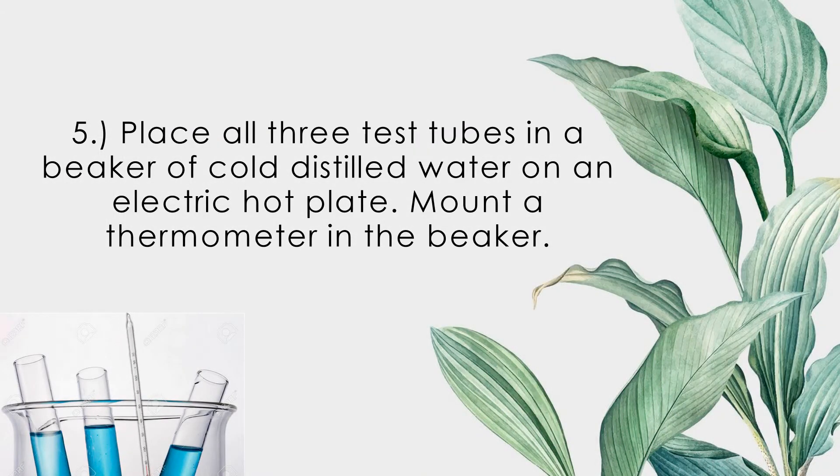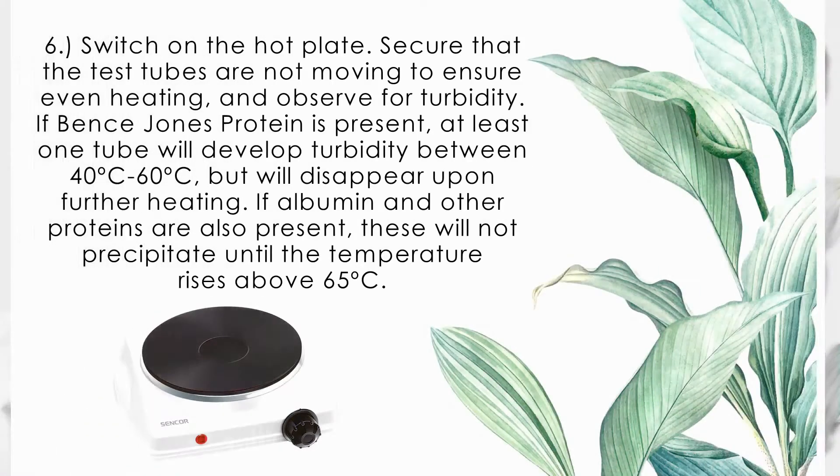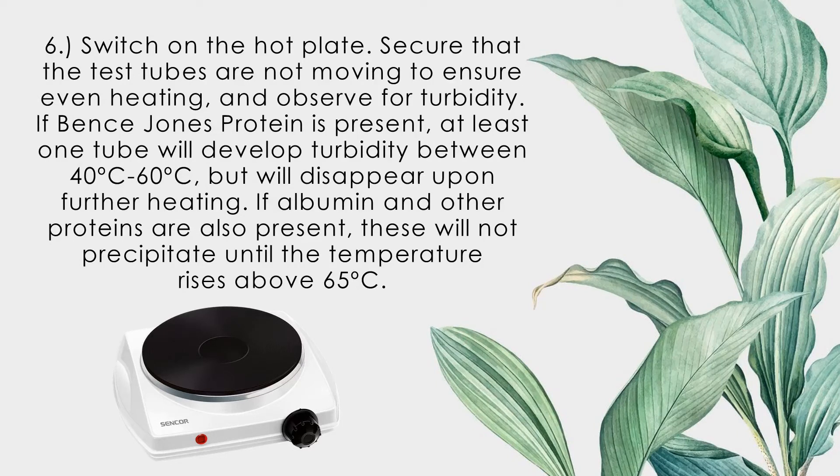Place all three test tubes in a beaker of cold distilled water on an electric hot plate. Mount a thermometer in the beaker. Switch on the hot plate. Secure that the test tubes are not moving to ensure even heating, and observe for turbidity.